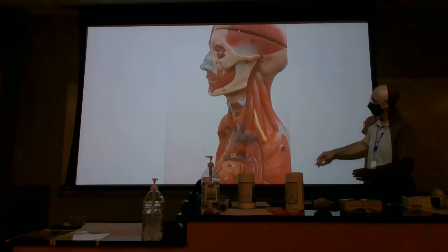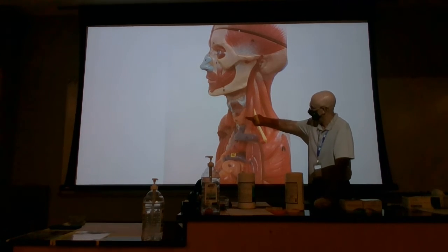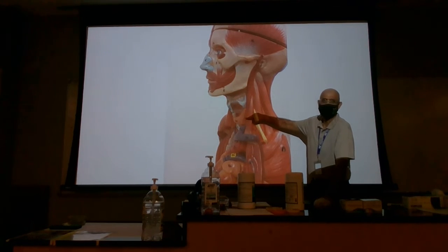Yeah, now you can see the... What is the name of this one? The examiner is pointing to this one. What would you call it? Loud, come on. It is the left common carotid, agree?